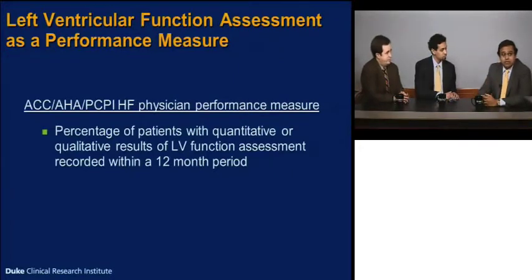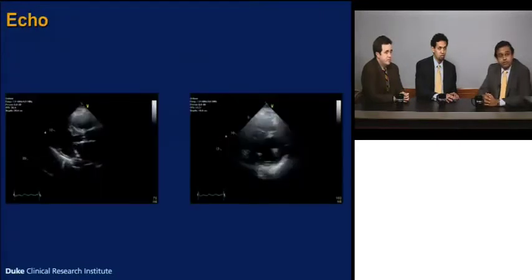I think most people caring for this patient would probably get an echo on presentation. I heard his renal function's okay, but if his renal function is abnormal, it'd drive me even more to get an echo, because I want a non-invasive way that's not going to expose him to the ventriculography at catheterization that I'm assuming he's going to have, but maybe we'll talk about whether or not he needs to actually have that. Right. So Manesh, you wanted to see the echocardiogram.